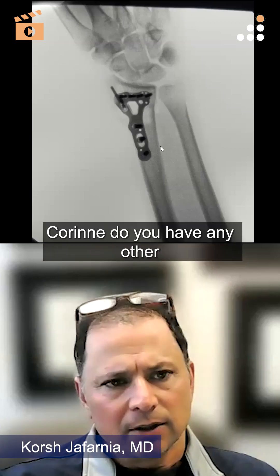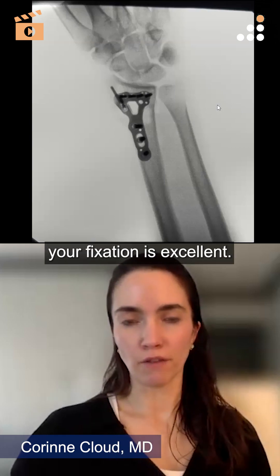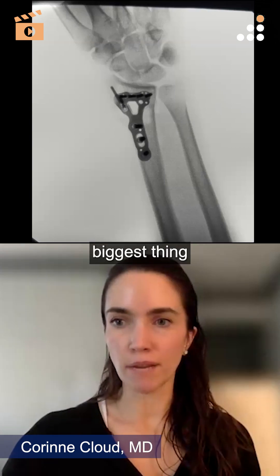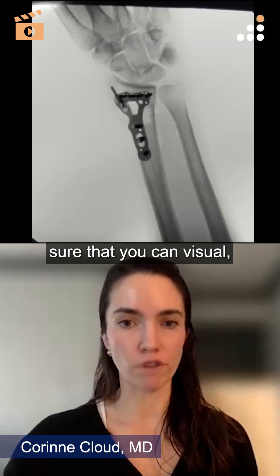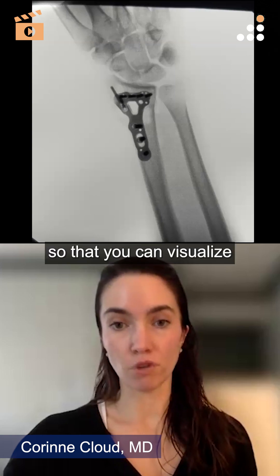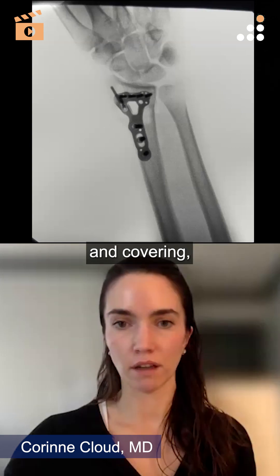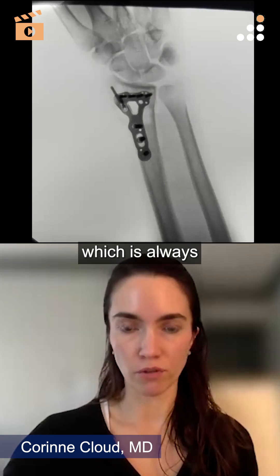Corinne, do you have any other thoughts? I think your fixation is excellent. The biggest thing for technique with your surgical approach is really making sure that you have enough incision and dissection so that you can visualize that volar ulnar corner, to make sure that your plate is appropriately placed and covering that portion of the distal radius.